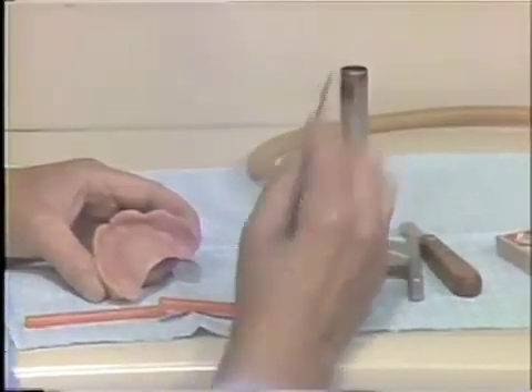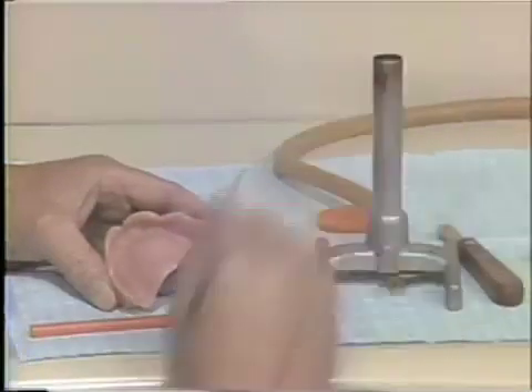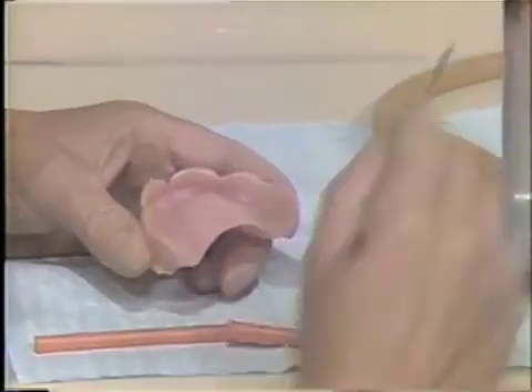Place a very thin film of sticky wax along the posterior border of the maxillary denture with a hot end of a number seven spatula.